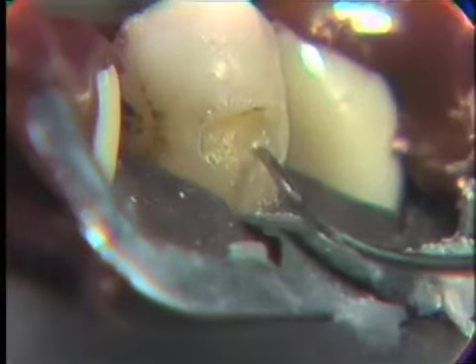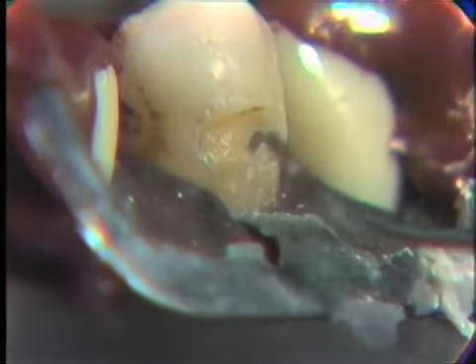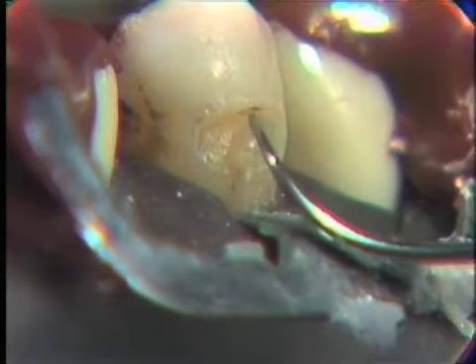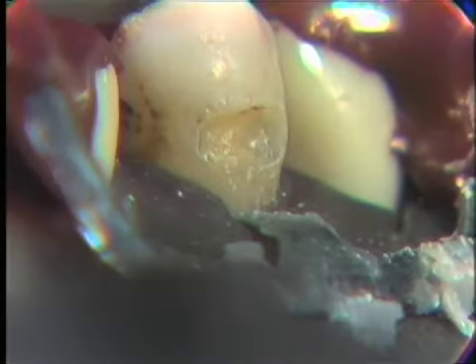Now, in this particular instance, we are going to have to put a small amount of retention to retain our zinc phosphate cement base. We'll put a bit of retention in the occlusal and in the cervical. Before we do that, we'll use a quarter round burr on our slow speed contra-angle, and we will put our retention in for the amalgam.